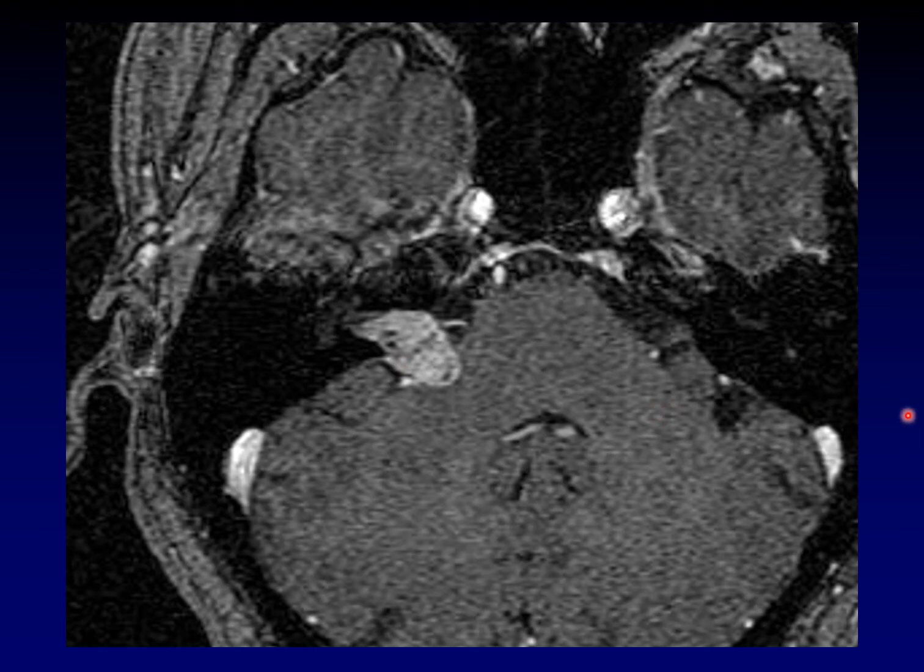When you run into situations like this, you have to look at all the different features and sort of average them out in your mind and decide how it adds up, sum it up in your head. In my mind, this has more features of acoustic neuroma, the extent into the IAC really telling in this case for me. So that's a vestibular schwannoma.